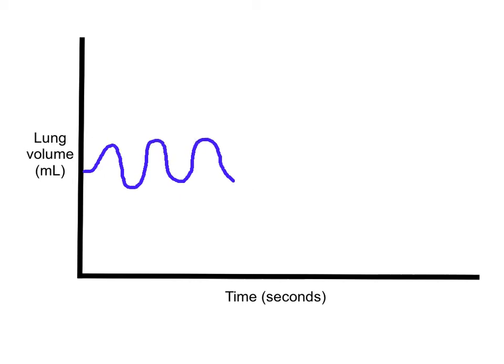Now, after a few quiet breaths, take a deep breath. Inhale as deep as you can. Get those accessory muscles working. Now exhale as strong as you can. Get out as much air as possible.